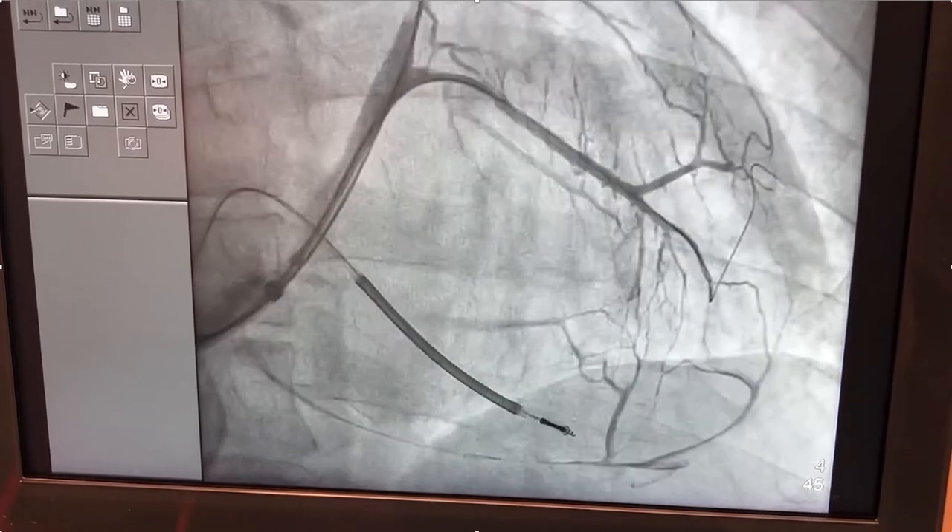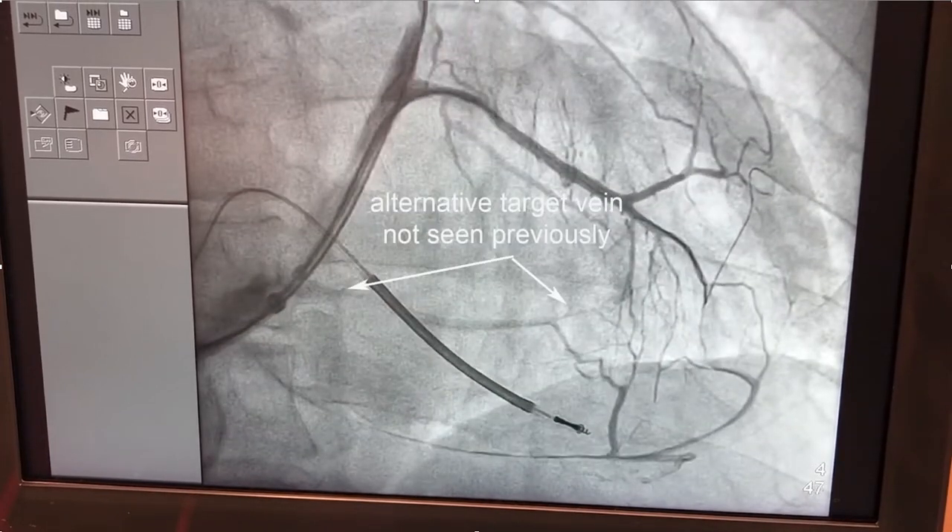So if you're having trouble seeing branches, not only will a selective venogram show you side branches and side branch options, but you'll also oftentimes see lateral wall branches that were not seen previously. I hope you find this helpful.